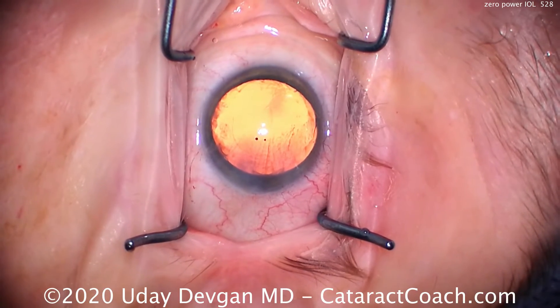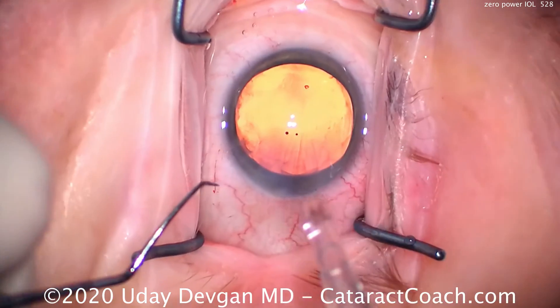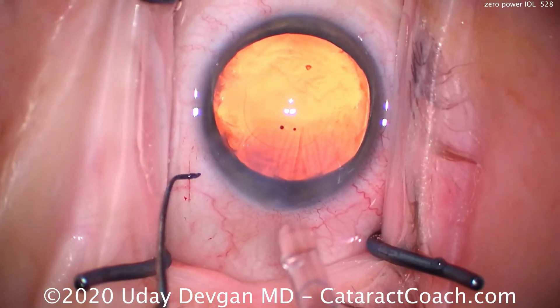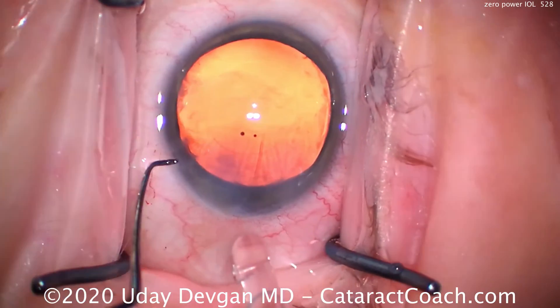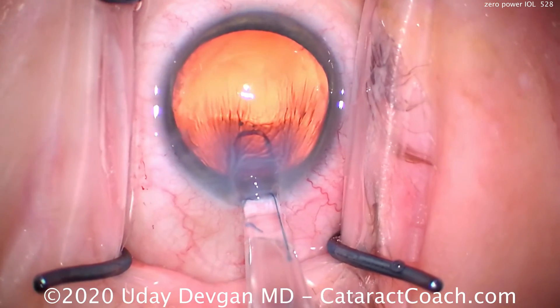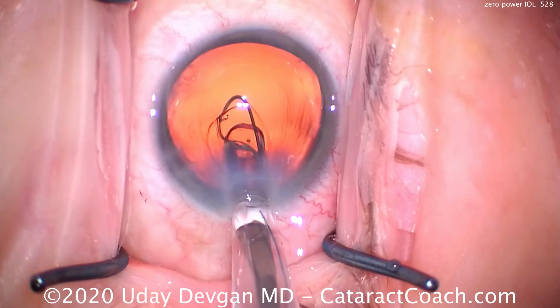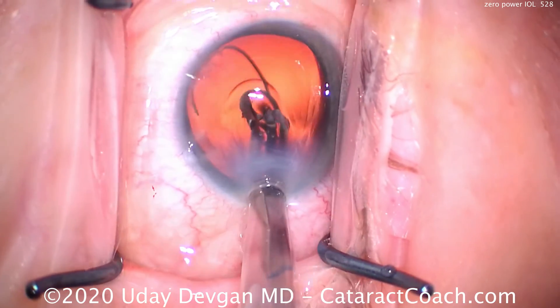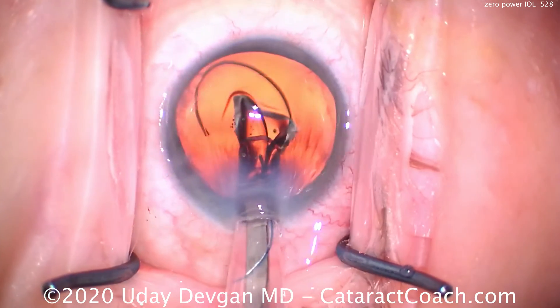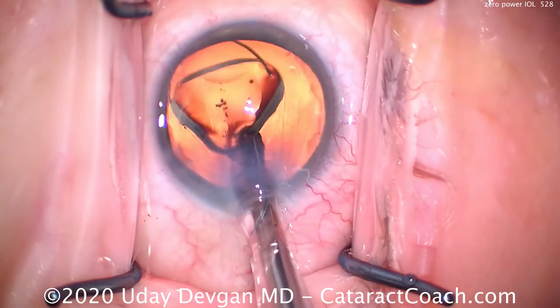So let's implant the lens. Zoom in a little bit — squirt the cornea — and here comes our lens. The advantage of the C cartridge is you can go through an unenlarged 2.75-millimeter incision. If you're using the B cartridge, you may have to enlarge the incision. The leading haptic should come out looking like a number seven, and it opens perfectly — looks great. And here's the optic unfolding. You can see how thick the lens is for a zero-power lens.